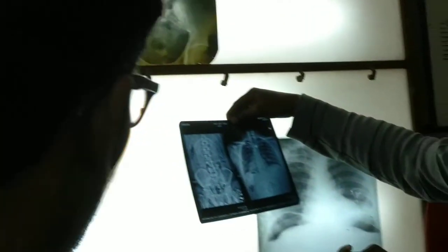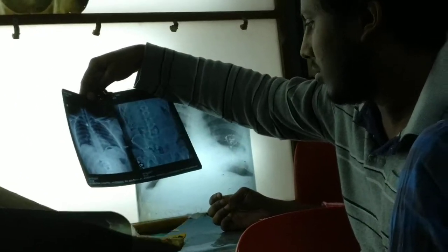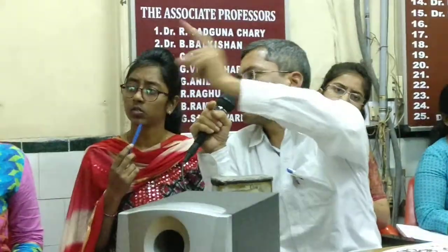So different causes you have to tell. At least carcinoma, differential diagnosis. Then any congenital causes, they may ask you. So that you remember. You just name the X-ray. Suppose the X-ray is displayed like that, they may ask what it tells. So you tell them, sir, Staghorn Calculus kidney. Then they may ask you different causes, investigations, management, all that.